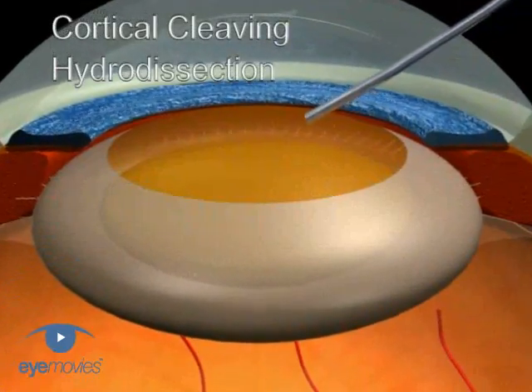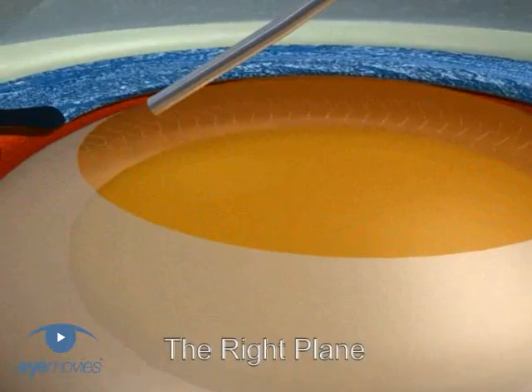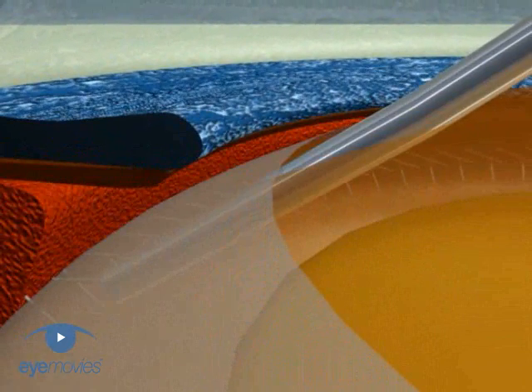To successfully perform cortical cleaving hydro dissection, you first need to get the cannula in the right plane. This plane is in the superficial cortex just beneath the overlying capsule, so you need to slide in the cannula flush underneath the edge of the rexis.